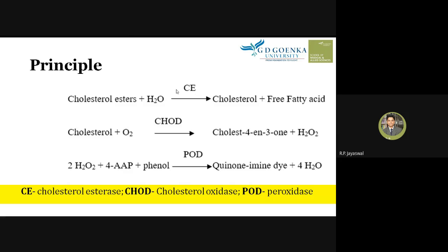So we can say this method is very specific. One enzyme, one substrate. If you study enzymology, this concept is one enzyme, one reaction. So here the enzymes can bind to their respective substrate.